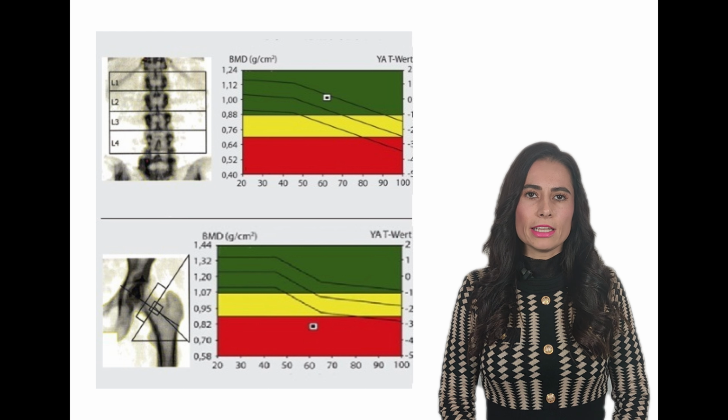A large and significant difference in T-score occurs when, for example, the spine shows normal bone density while the hip shows osteoporosis. This typically happens if the difference in the two T-scores is greater than or equal to 2 standard deviations. This difference can indicate how accurate the osteodensitometer is.